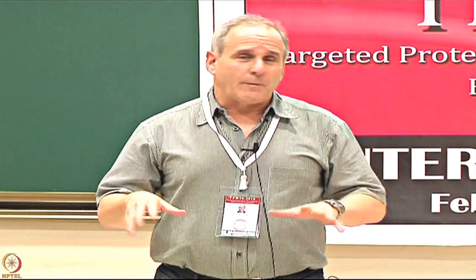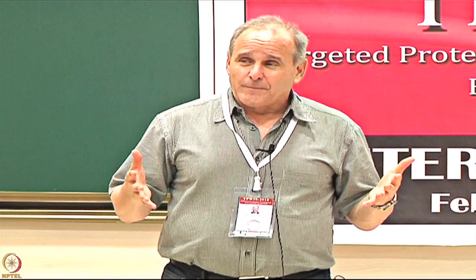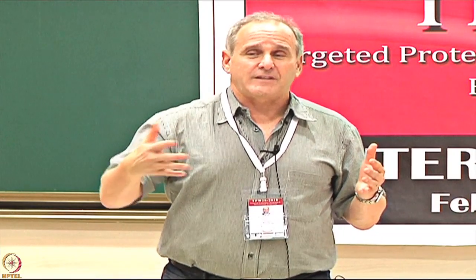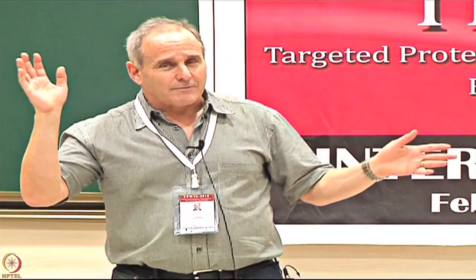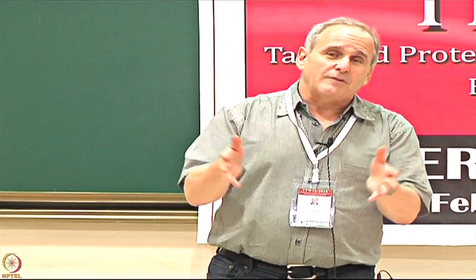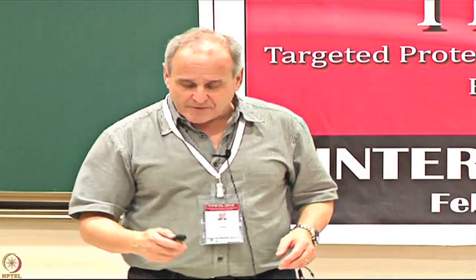So once we've done our initial study where we compared, let's say, 50 cases to 50 controls, right? So that's 100 array sets of 15,000 each. When we get to the next stage, we don't necessarily want to test all 15,000 proteins. We've now eliminated most of those proteins. We now know that of that 15,000, 14,850 of them are probably not good markers. We can toss those out. So now I don't want to have to use my big chip that does all those proteins. I want to focus on 150 candidate markers in my next study. And so that's where this next platform becomes very helpful.